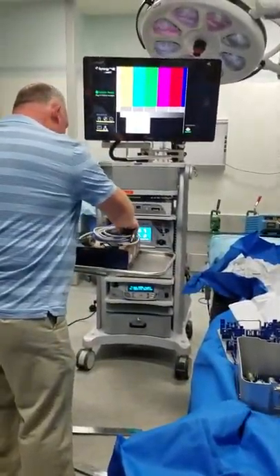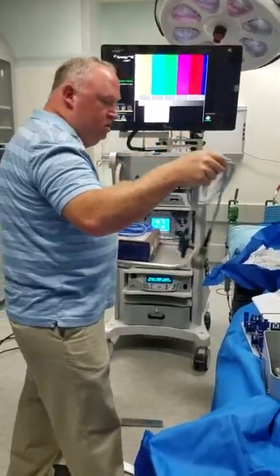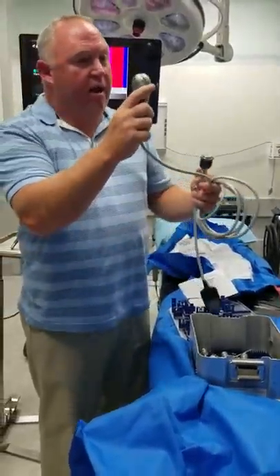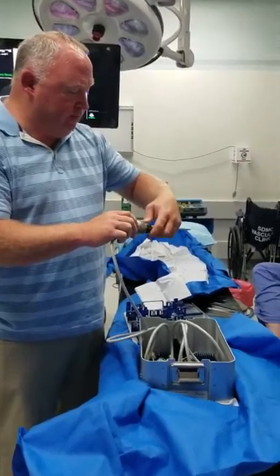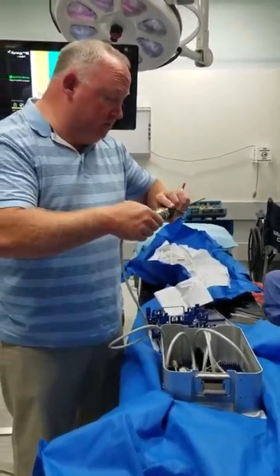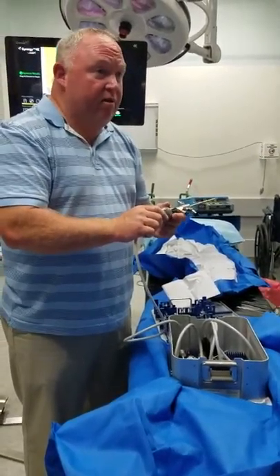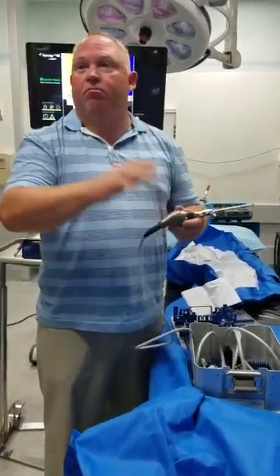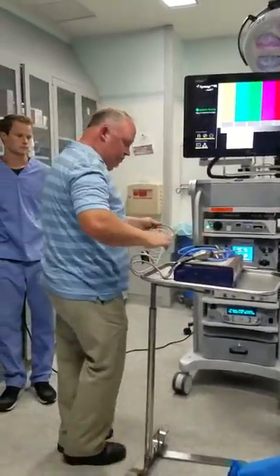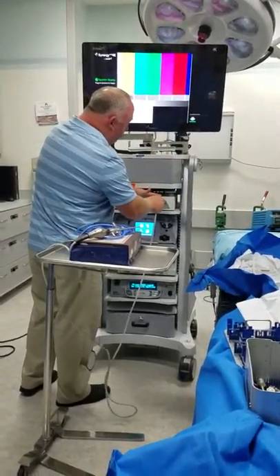Okay. Obviously, there's a correct side that stays on the field and a part that's off the field. That's the part that plugs into the actual camera or the system. When it comes to prepping all of this, the scrub tech usually does it. Every once in a while, you might be the one there. Every once in a while, you're the person that, for whatever reason, in the middle of the night, everybody in the room does something else. They don't do ortho very often. You might be the most experienced person in the room doing ortho. So I'll plug this in first. It says up, even, believe it or not. Kind of idiot proof.